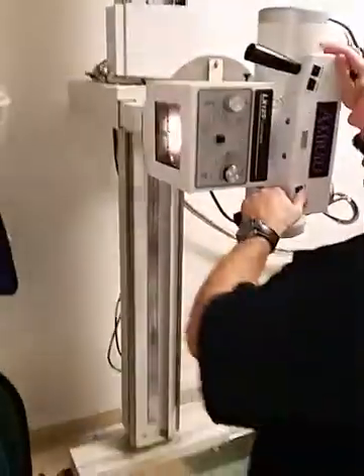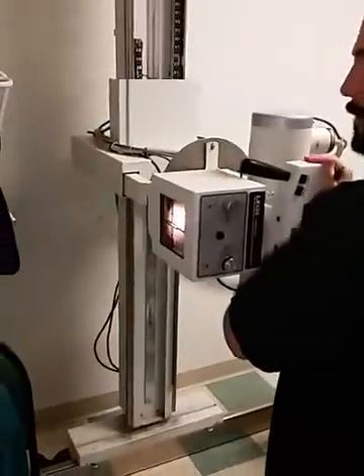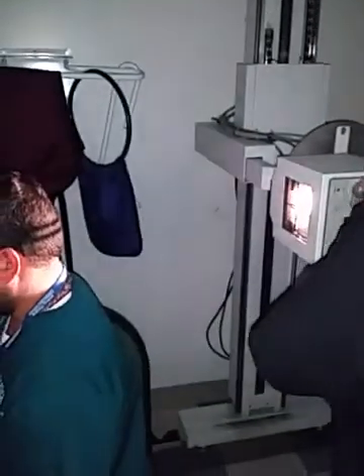All right. So now I'm going to take the angulation off. Now we're going to do our two laterals because it makes sense. We just did our PA. So now we're going to come down and do our laterals. Open up my light field so we can see what we're doing again. And in this case, we're going to do our right lateral.